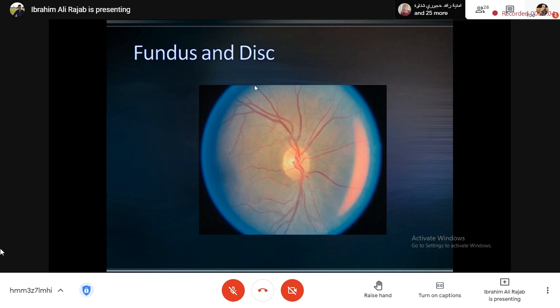Amna started with the optic disc, and she said that the disc is well demarcated.